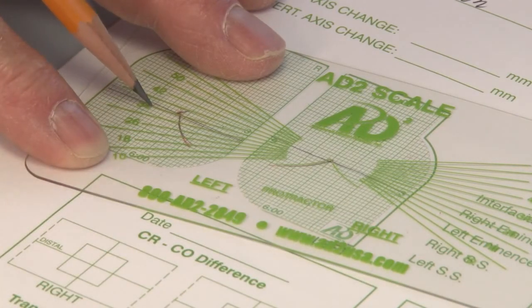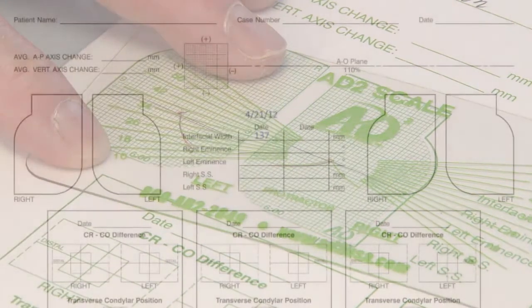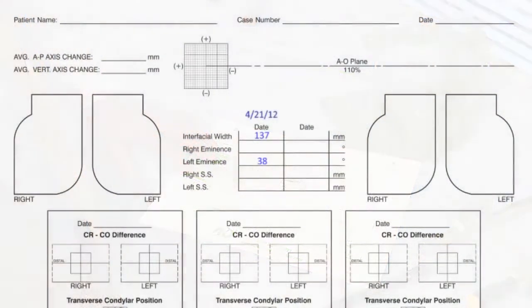This line is 34 degrees, this line is 42, so that's 38 degrees. That line is 38 degrees. So on the left side, the angle of the eminence is 38 degrees. So I'll record that on the patient's chart. And now we have to do the right side. This one measures 42 degrees. So the right angle of the eminence is 42, the left is 38.